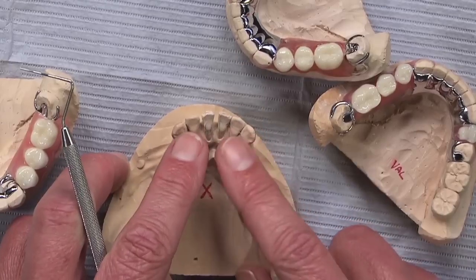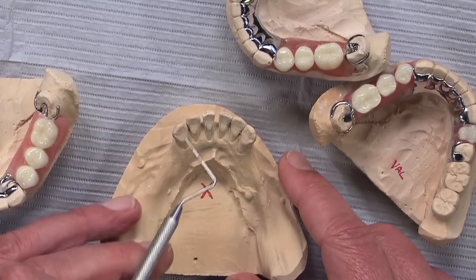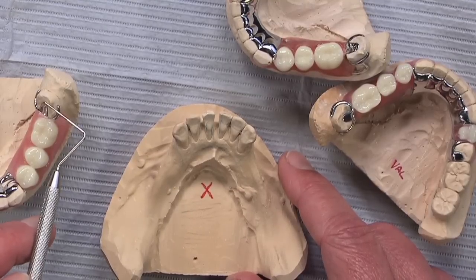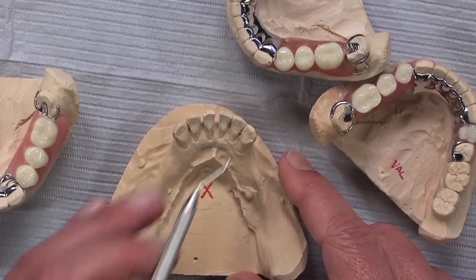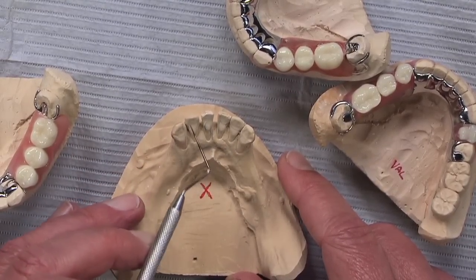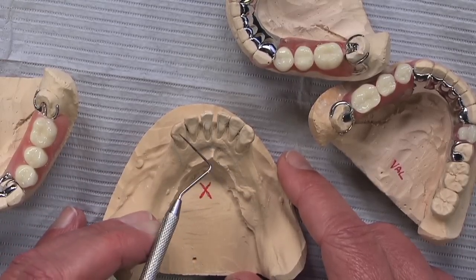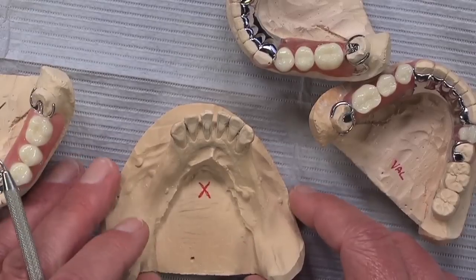This is a really good area. Anytime we have teeth left, we're going to want to rely on them for a stop. But of course, if we have a molar here, it's very easy to do an occlusal stop, and we have this whole flat surface like we have on this bicuspid. But because of the slant on the lingual surfaces of these anterior teeth, we're going to need to go in and prep a little rest prep here and here. And then we're going to have a frame that's not going to want to overseat.